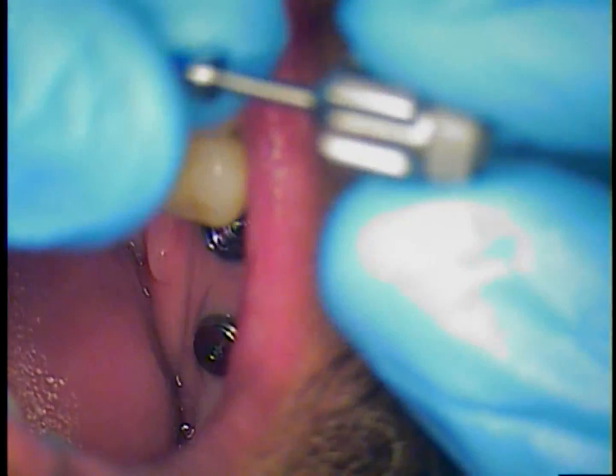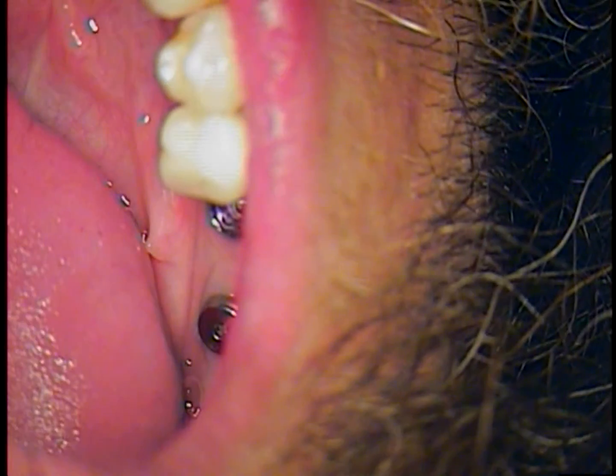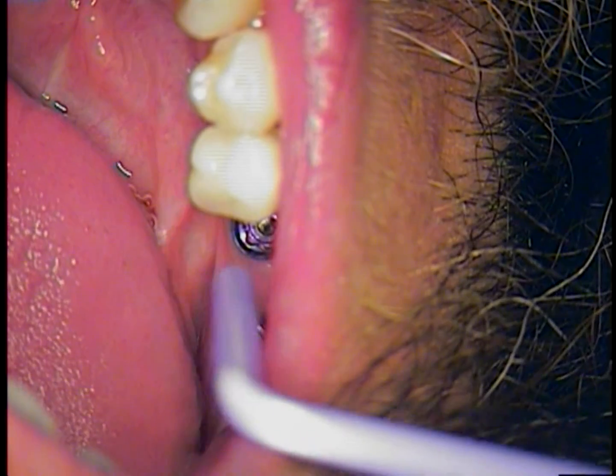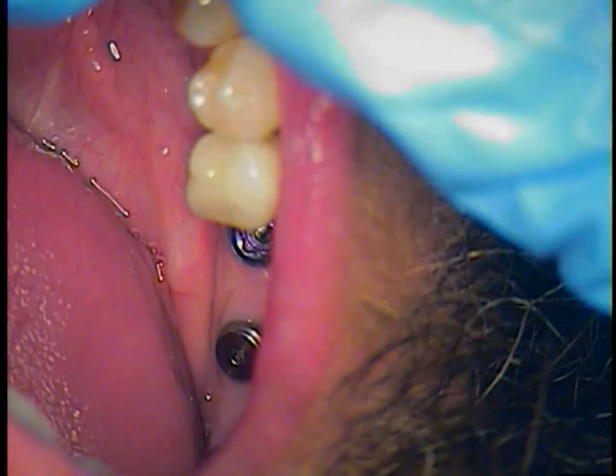Hello and welcome back. This is Dr. Jerry Cuomo. I'm here with the finale now. We have the cover screw ready to go in on this case. It's a rescue case referred to me by a dentist in Miami.